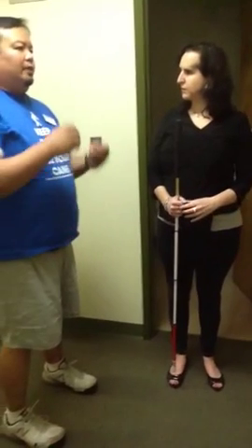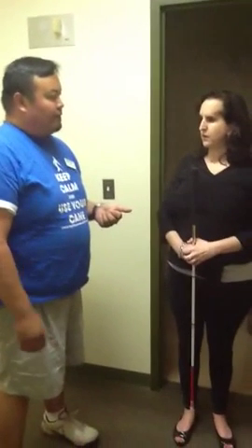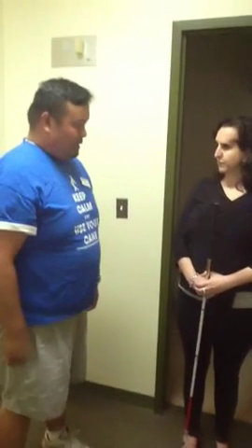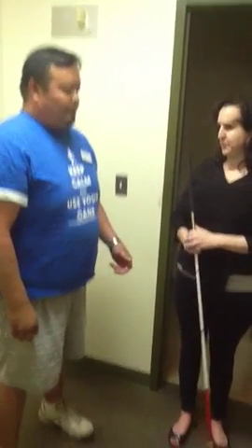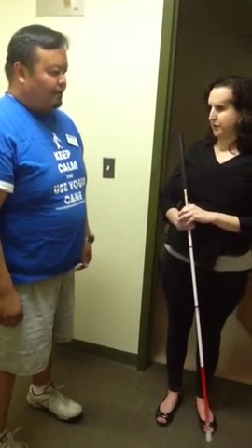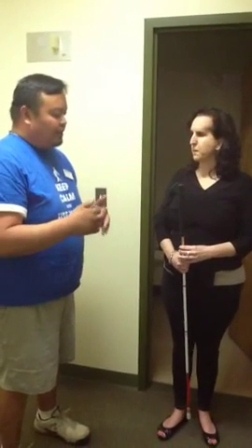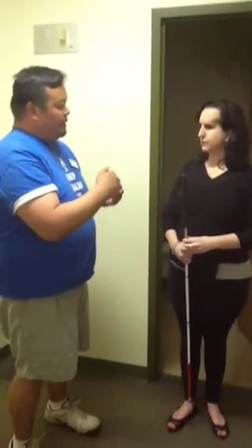So we passed a total, how many doors again? 5. And starting from this door, working your way around, please name the doors or the rooms. The women's restroom, the men's restroom, the small conference room. There's another restroom and then early intervention. Okay. In the future we'll keep building on it so that you know all the placements of all the doors, so you have a general idea, a mental map of what is in that door.